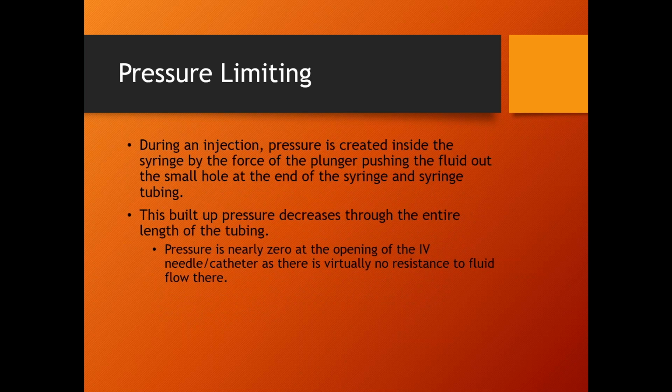Pressure limiting. Now, I need to tell you a bunch of stuff about other things before we get to pressure limiting, so this is my display, and I tried to lay the room out a little bit. I know people on the edges probably have a difficult time seeing here, but this is my display. This is where the operator is going to punch in what the protocol is going to be. We're going to shoot this patient with this injection. Now, every protocol has to have 3 things selected on it.